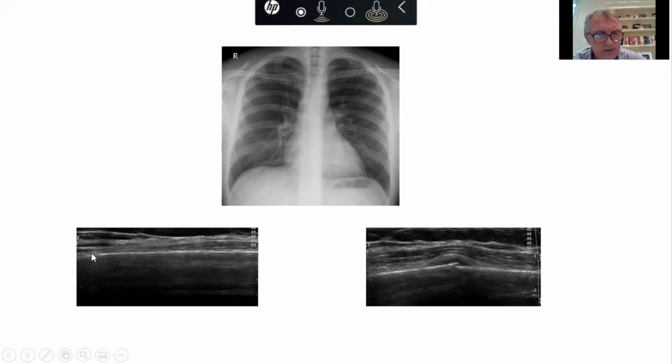Again, bone was thought to be of no value. Ultrasound was thought to be of no value in imaging bone because it's highly reflective. There's no image behind it. But when bone becomes abnormal, it's often replaced by soft tissue or fluid. And this is the cortex here. So here's a normal rib cortex, the diaphysis, and here's the cortex here, and there is a small loss of alignment. There's a fracture here. And the important thing is there's fluid. All fractures, all bone, when fractured, bleed. Bone is highly vascular, and this is a subperiosteal hematoma, and that's a rib fracture.